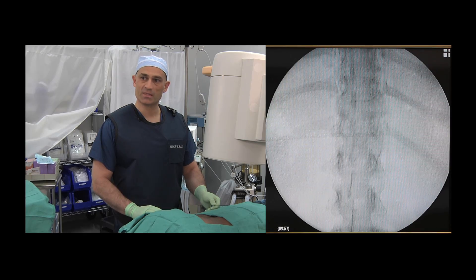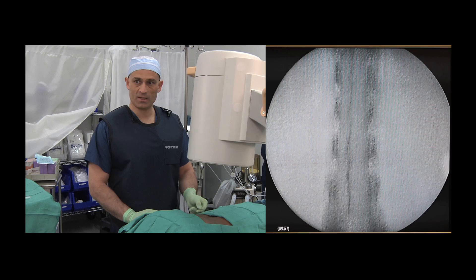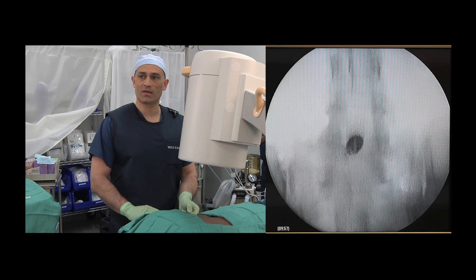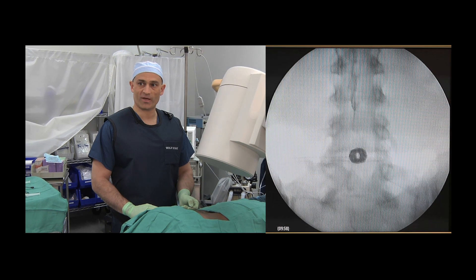The procedure has commenced with the identification of the correct intervertebral level. The needle is placed over the T12 vertebrae, and we count down L1, L2, L3, L4, L5. This is the L5-S1 lumbar intervertebral space. The intervertebral plates are then squared off by rotating the C-arm in a cranio-caudal fashion.